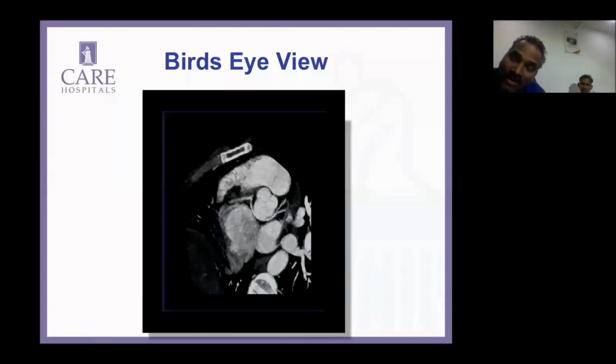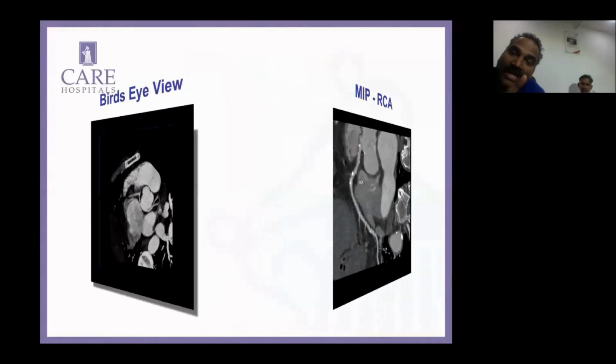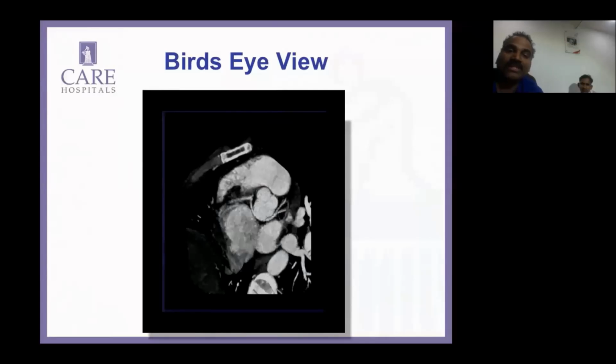The ostium will be oval, and there is a bend immediately after the ostium, which may appear as a lesion in your conventional angiogram. This I have observed quite commonly in abnormal RCA origins from the left sinus, and a similar thing happens here. So even if I do a conventional angiogram, I may end up needing a CT angiogram for this case.